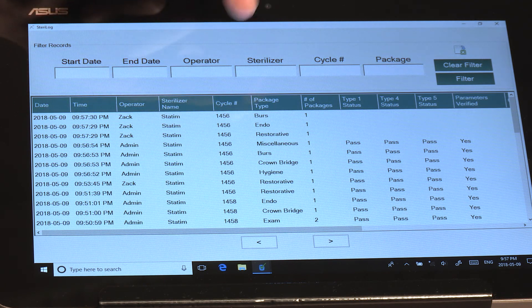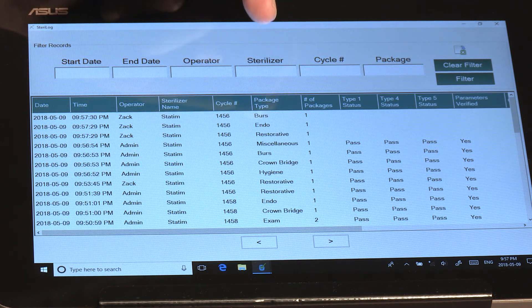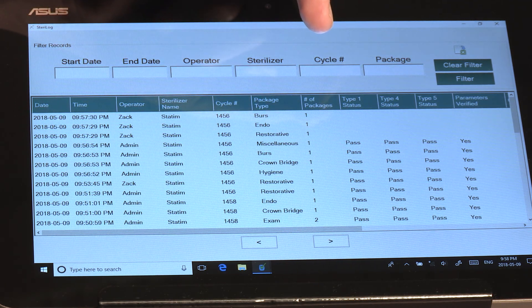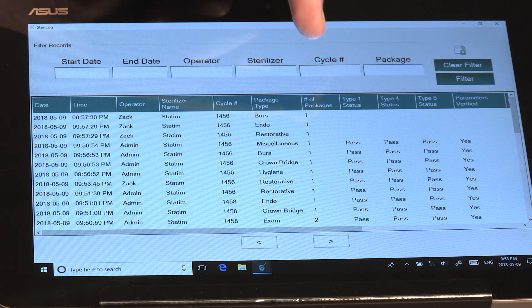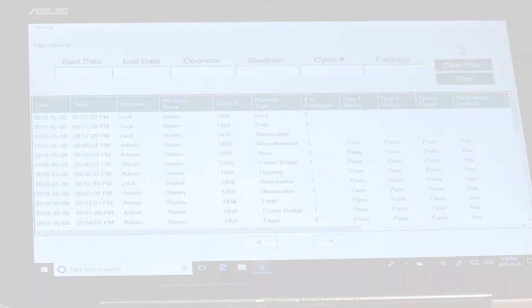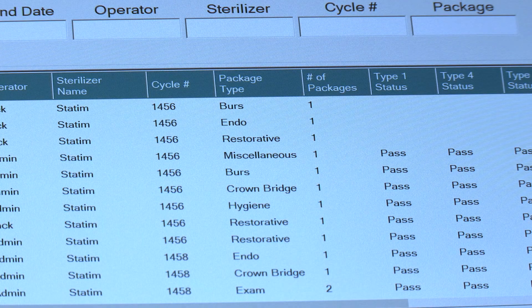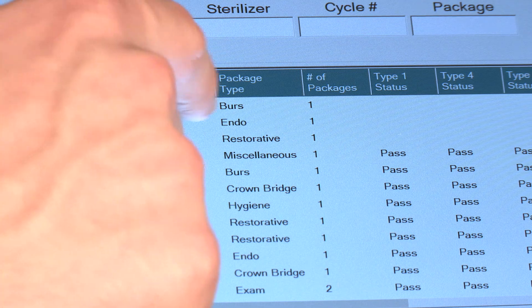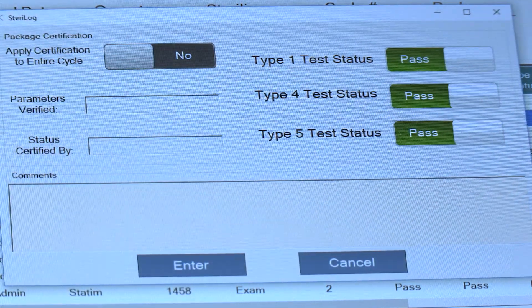the sterilizer, cycle number, package type, as well as the number of packages and your test results which have not been certified yet. So you locate your cycle number and select it for certification.